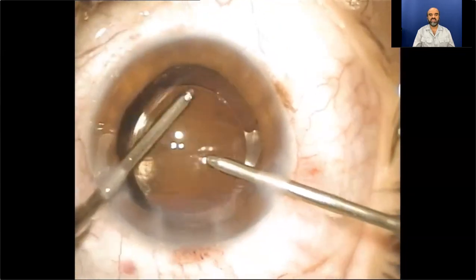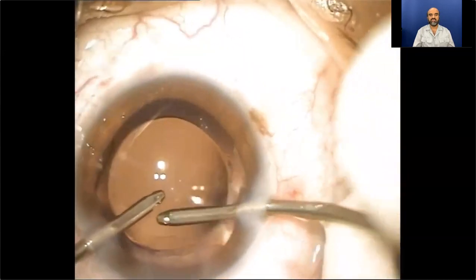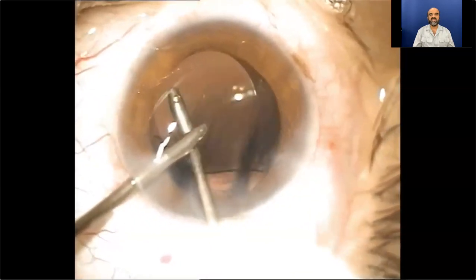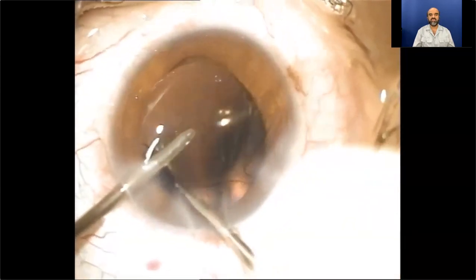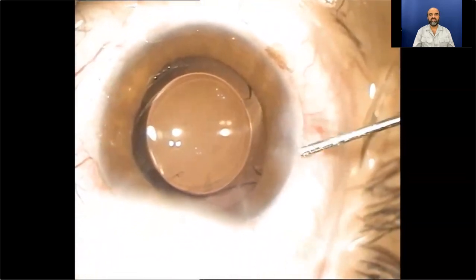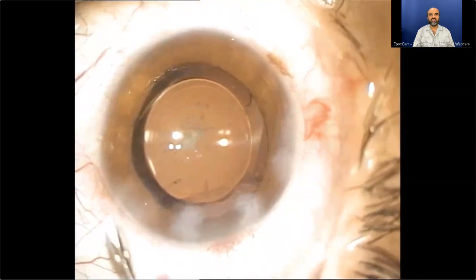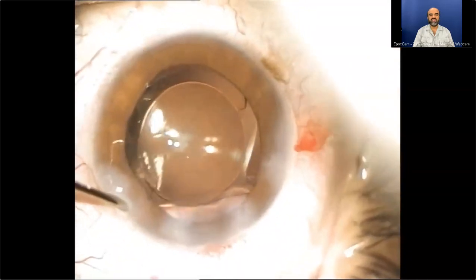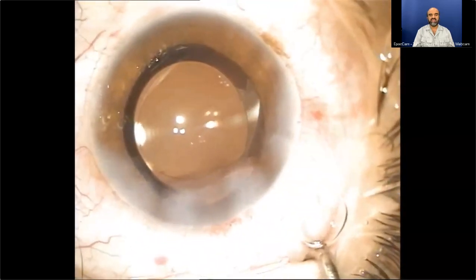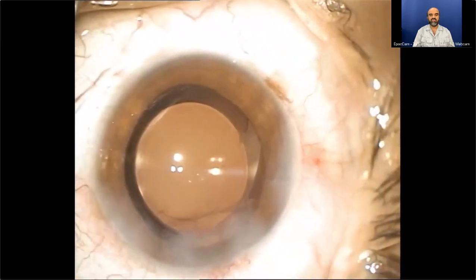Fine polishing and removal of viscoelastic material from the anterior chamber is performed, and it also goes behind the lens to clear the viscoelastic from its posterior surface. Finally, as in all cases, a little hydro-infusion of the corneal stroma closes the self-sealing incisions. The chamber is deepened and the aim is to leave the eye tense at the end of the procedure. It's a beautifully centered IOL.